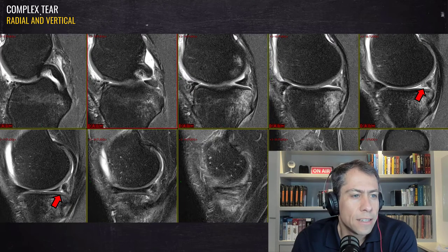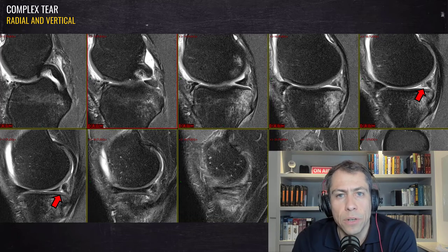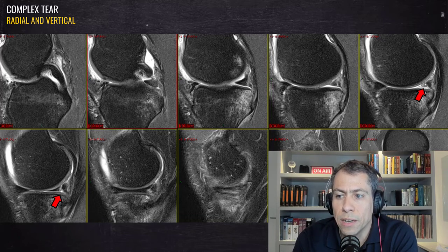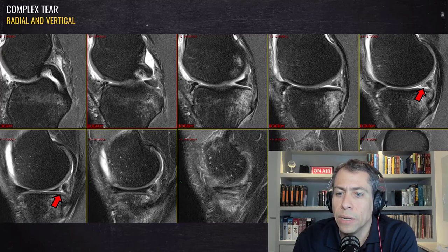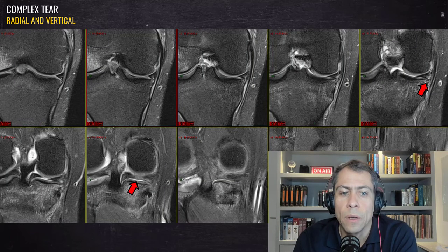In this first case, this is a complex tear of the posterior horn of the medial meniscus with two components: a radial partial tear and a vertical longitudinal tear. We can see the partial radial tear — the partial cleft sign — right here in the short axis of the meniscus, and we can also identify the vertical longitudinal tear in this region on the sagittal plane.